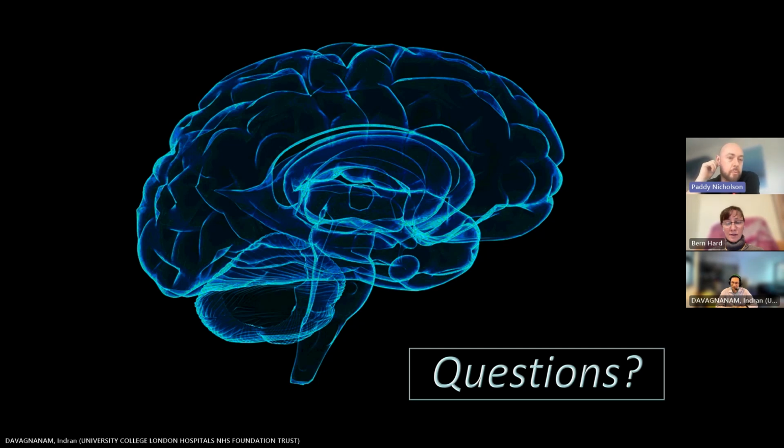There were a couple of case reports about it in 2017, 2018, and it basically relates to the nature or the shape of the edema between the interspinous processes on the sagittal T2 weighted imaging of a spinal MRI. But to be honest, I don't use it. I don't teach it to people when I'm giving lectures on this. I haven't seen it commonly used in CSF leak talks.